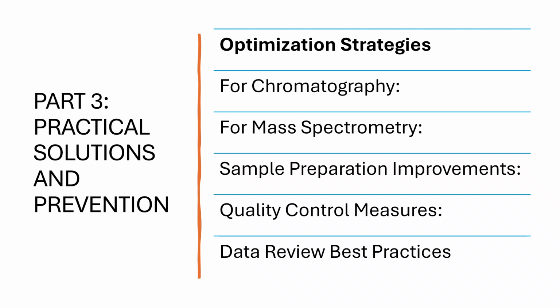Significant differences warrant investigation. Use consistent integration parameters across all samples in a batch. When in doubt, reanalyze the confirmation methods or alternative techniques.